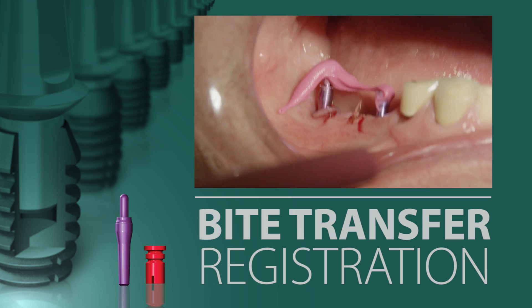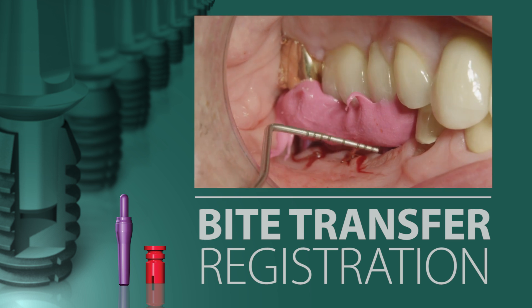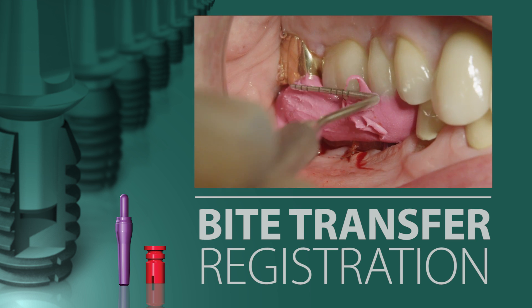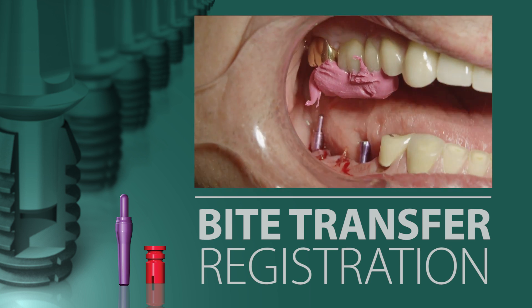The patient then closes into the material and, if necessary, more material is applied. Once the material has set, the bite registration is removed.